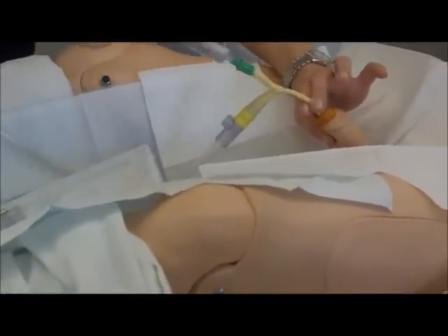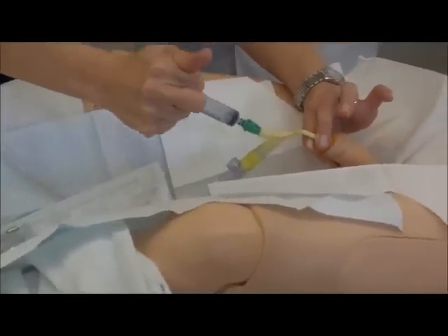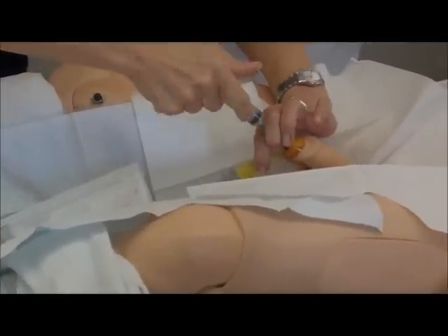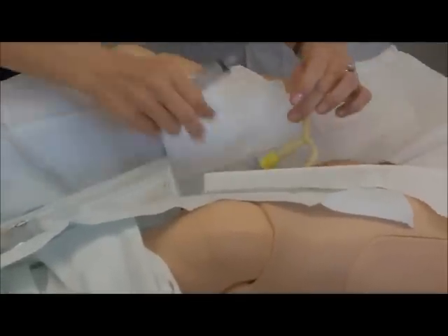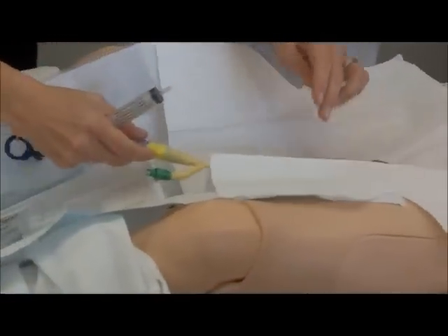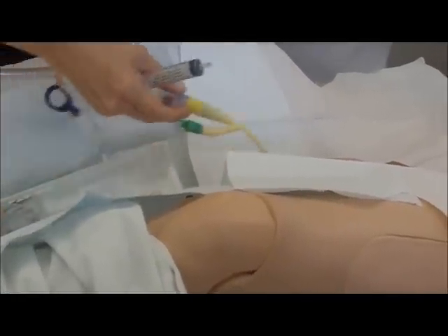It's already in. Make sure that you hold. And you take this off right away, or else — see, it's going back in. Take it off. Tug back slowly until there's resistance. And then you're done.